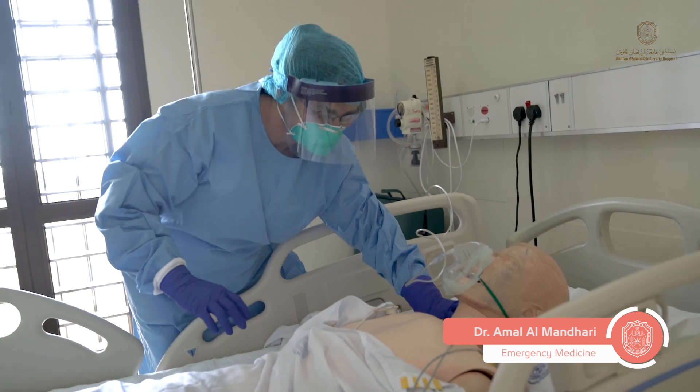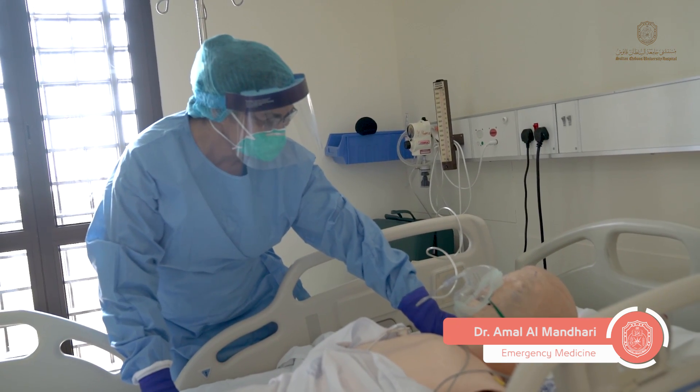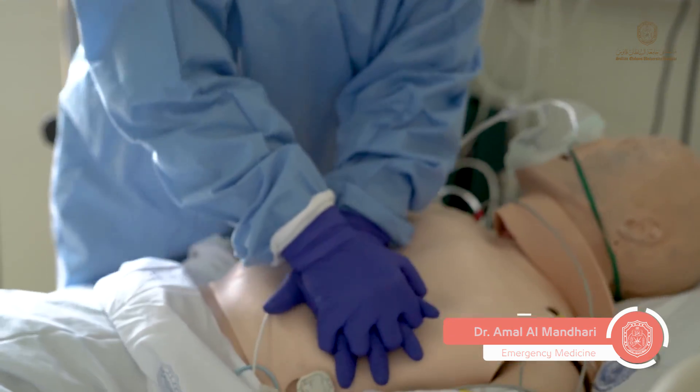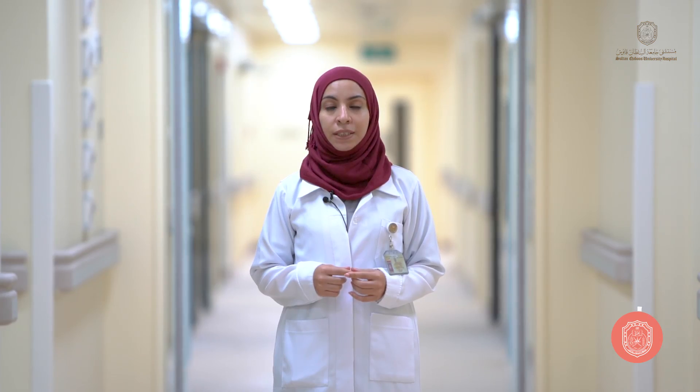During BLS assessment of a suspected or confirmed COVID patient, check pulse and breathing while avoiding close proximity to the patient. Start chest compressions and apply a non-rebreather face mask, avoiding bag mask ventilation. If possible, bring the defibrillator and required medications inside the room while keeping the crash trolley outside the room to minimize contamination.